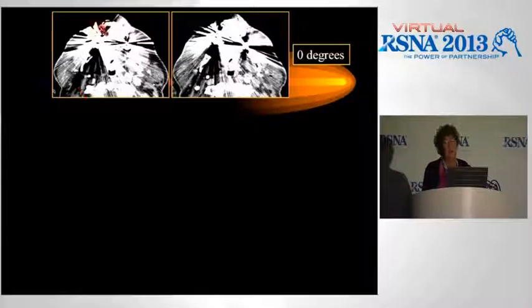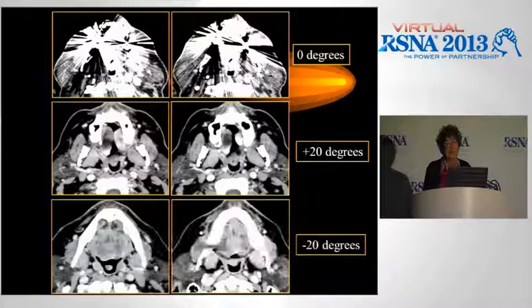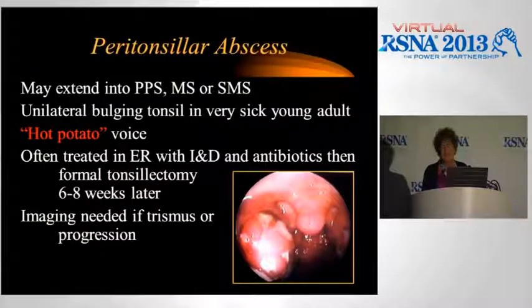So here we are in that patient at 0 degrees. You can't see anything. Here we are at plus 20 degrees and minus 20 degrees with a very good view of everything posterior to the amalgam artifact. And I'll show you the use of that.